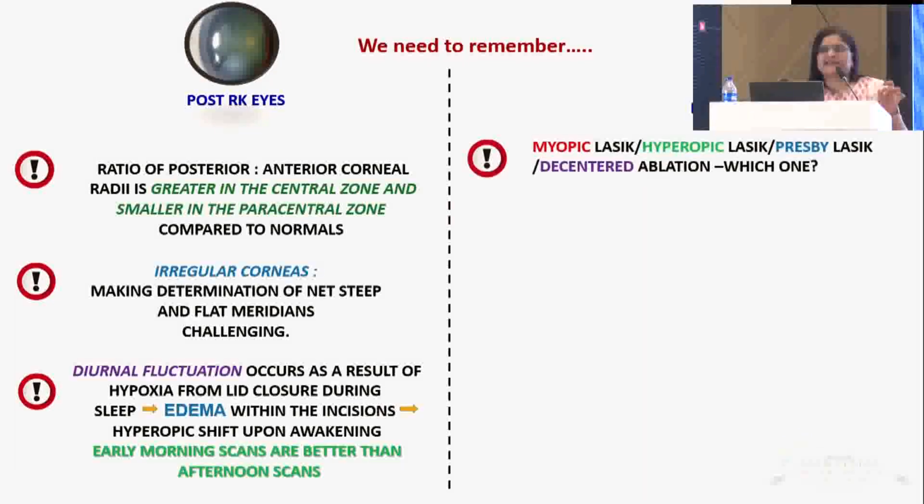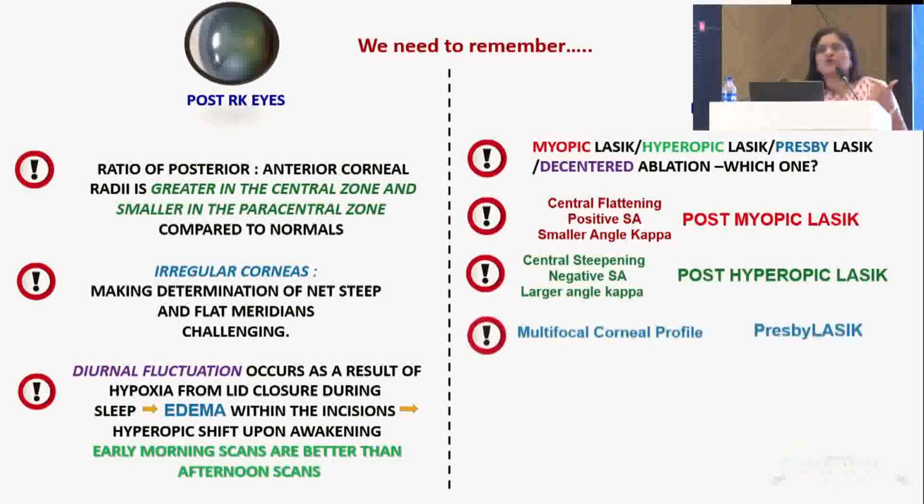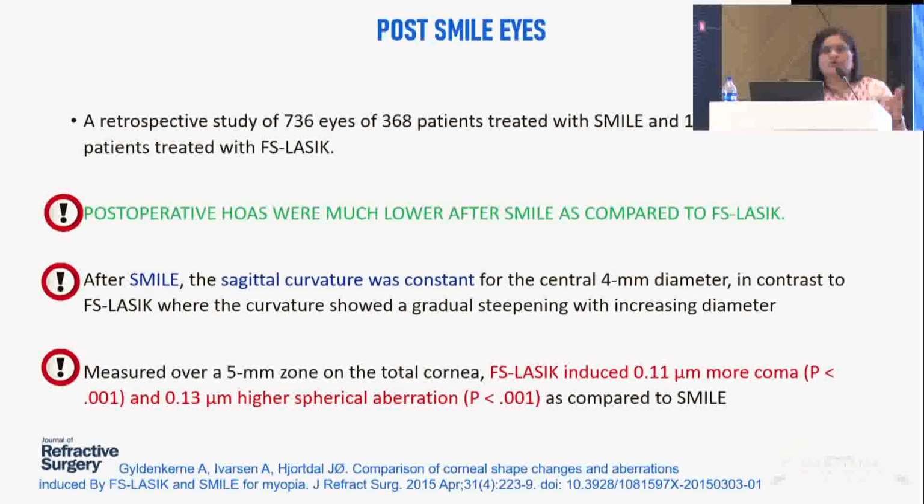In post-LASIK eyes, you have to first of all decide what kind of LASIK was done. Was it myopic LASIK? Was it hyperopic LASIK? Was it presbyLASIK? Or is it a decentered ablation that you are dealing with? Having said this, think about post-SMILE eyes.